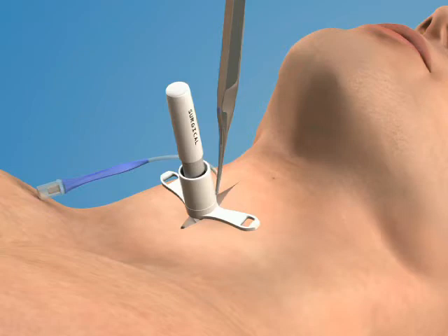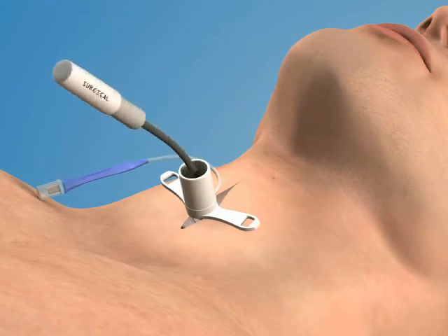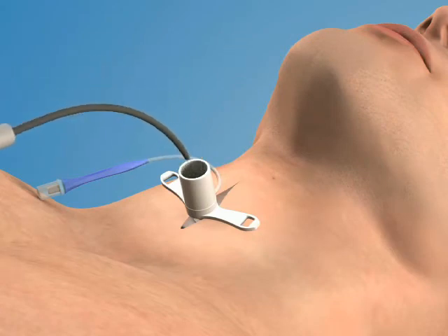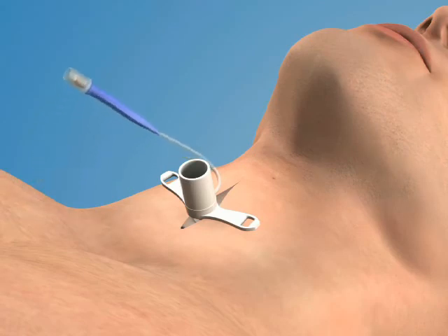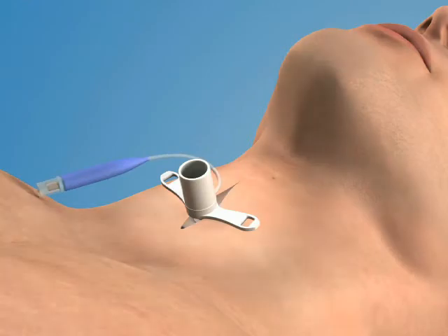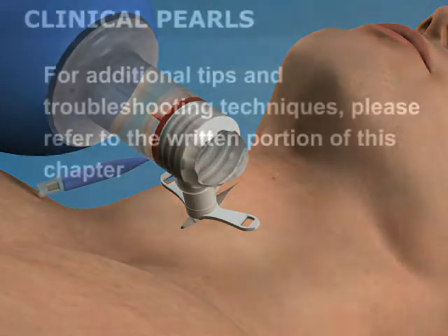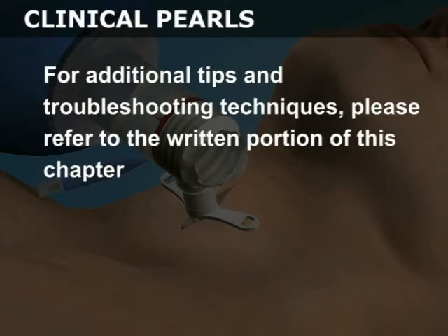Once the tube has been fully inserted, you can remove the tracheal hook and the obturator from the airway catheter. Finally, inflate the cuff with air and begin to ventilate the patient with a bag valve mask. For additional tips and troubleshooting techniques, please refer to the written portion of this chapter.